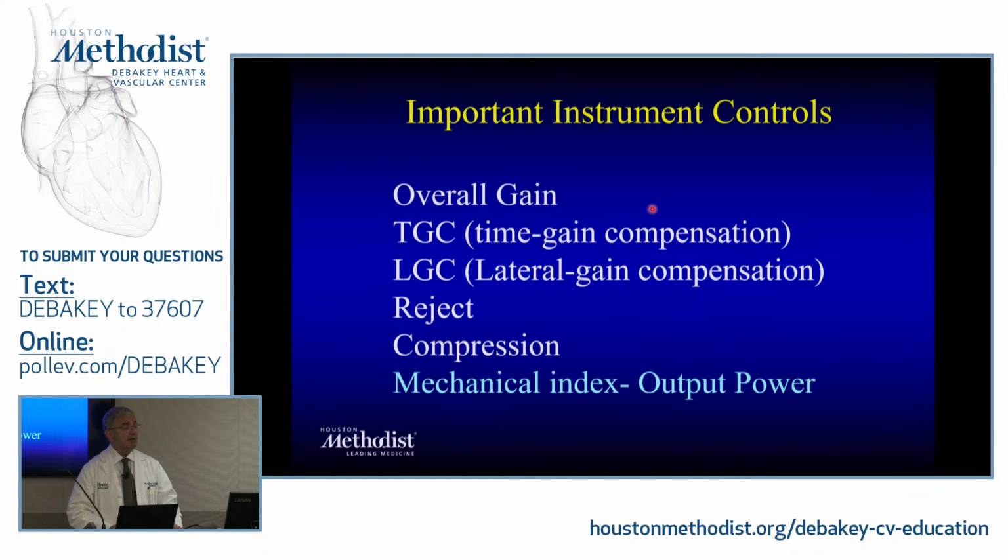Just like you're driving a car, you need to know what the instrument controls are for you. We have overall gain, so you can increase the gain. And remember, this is what's reflected back into the ultrasound itself. Time gain compensation. Why is it time gain compensation? I'm increasing the gain at a certain depth. And remember, depth is time, so it's time gain compensation. Lateral gain compensation, reject, you bring them down, compression.